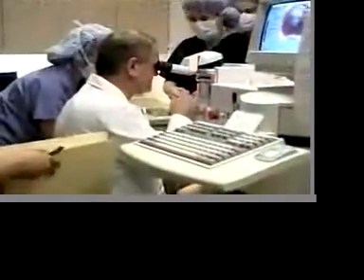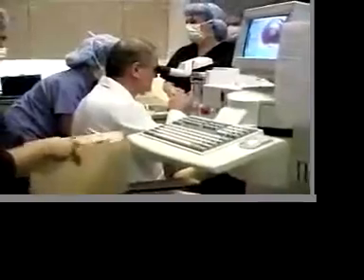And if they drift off a little bit, it's like a video game, and I follow them around, but it's obviously easier with them just looking at the light and not drifting. But the reassurance is there's nothing the patient can do to mess up the procedure, because if they look away, then I stop, line back up, and go on our way. That whole laser treatment usually lasts, for most prescriptions, less than 60 seconds, and for both eyes.